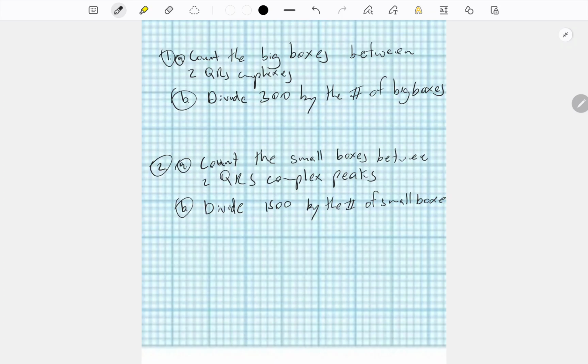That would give you a similar result, but likely more accurate.